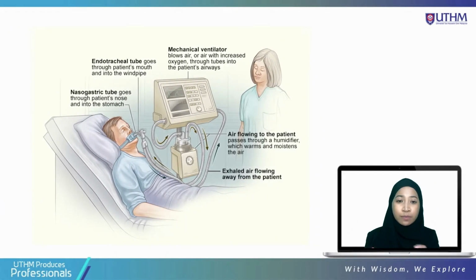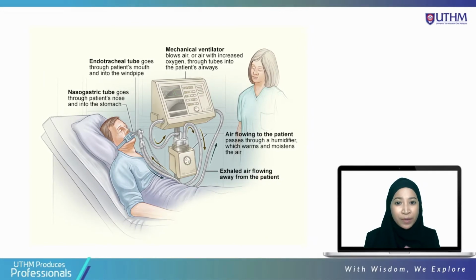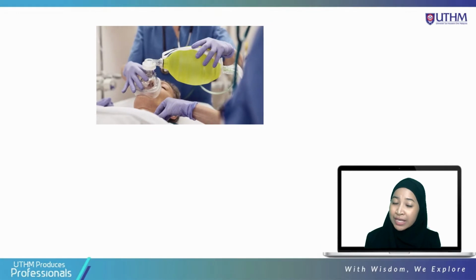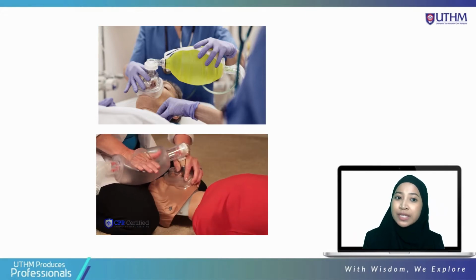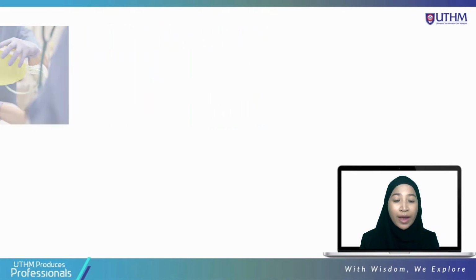A ventilator is a mechanical breathing assistant machine that helps to deliver air in and out of the lung to a patient who has a respiratory failure or has difficulties in breathing. The concept of the medical ventilator is taken from the bag valve mask (BVM), which is also known as the ambu bag. The ambu bag is used as a manual resuscitation kit for medical professionals in and out of hospitals, such as in an ambulance. When the bag is squeezed out and re-inflated rapidly, the air is forced in and out of the lung. This is the mechanism of the ambu bag.